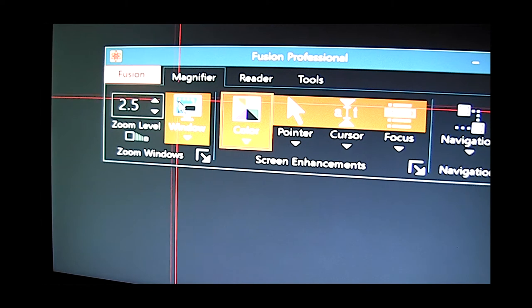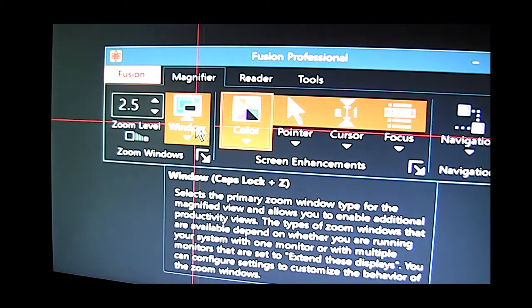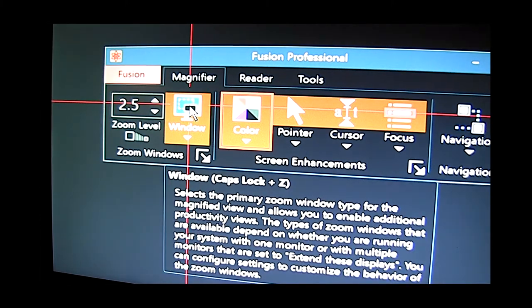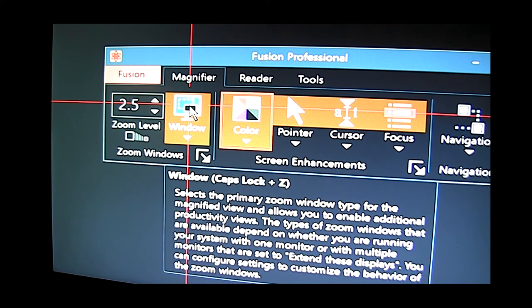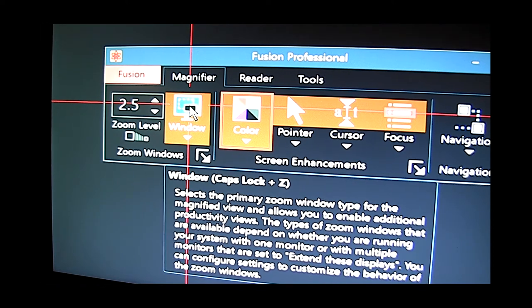It's also possible using these windows features to have extended desktop with two monitors perhaps a laptop and a secondary monitor to stretch across the two monitors or to have one magnified and one unmagnified and so on.